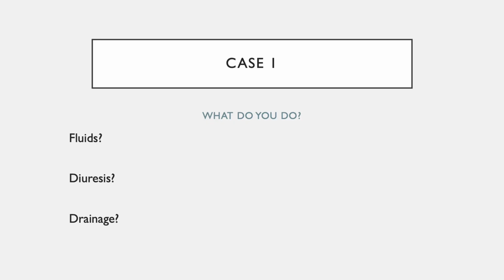So it may have been clinically obvious, even without POCUS, that this patient is presenting in decompensated heart failure. However, what the POCUS provides us is risk stratification and prognostic information based on the appearance of the patient's severe biventricular systolic dysfunction. He's quite high risk and ultimately required urgent admission with expedited workup and management.